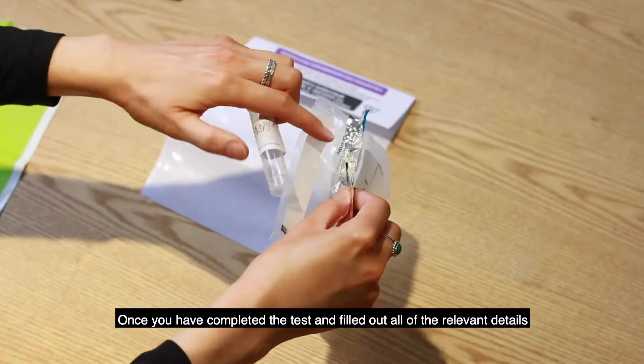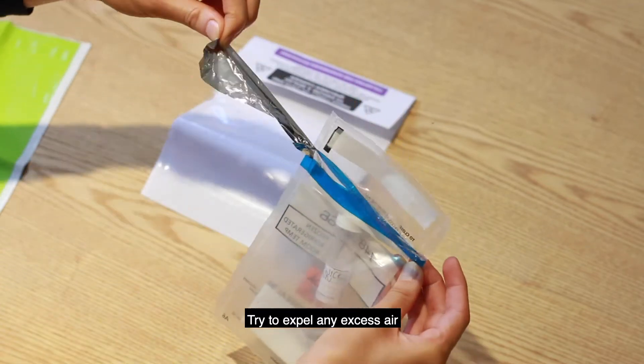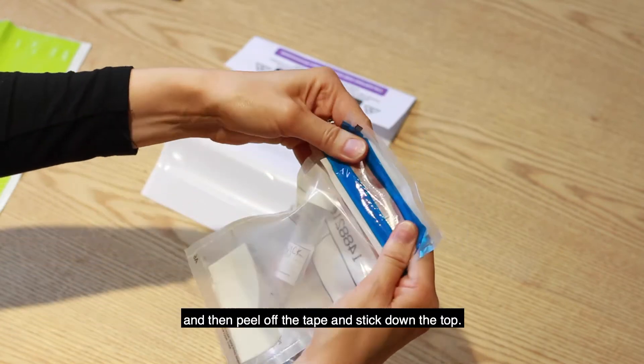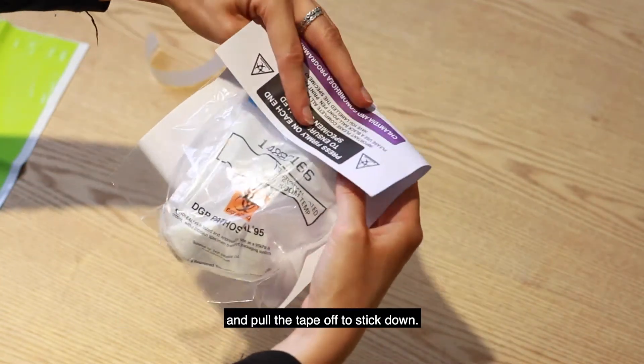Once you have completed the test and filled out all of the relevant details, carefully place the specimen tube in the small plastic bag. Try to expel any excess air and then peel off the tape and stick down the top. Place the small plastic bag into the plastic pouch at the back of the form and pull the tape off to stick down.